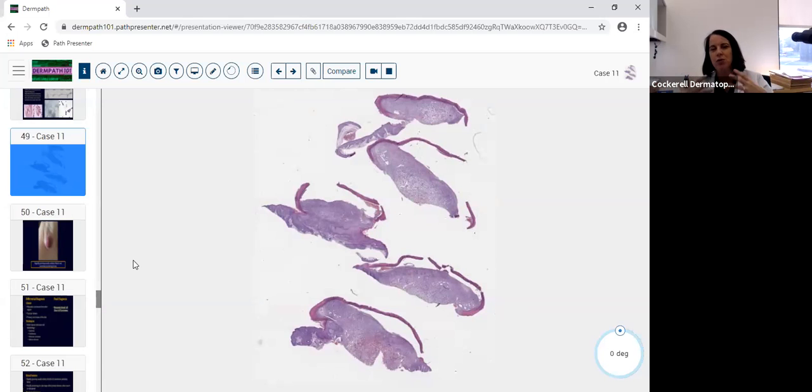We don't have such a beautiful case. We may just have a few scattered hyphae invading the nail plate. So we just say onychomycosis and go from there. So if you want more information, you might have to culture it to speciate it. That's pretty much all I wanted to say on the onychomycosis.